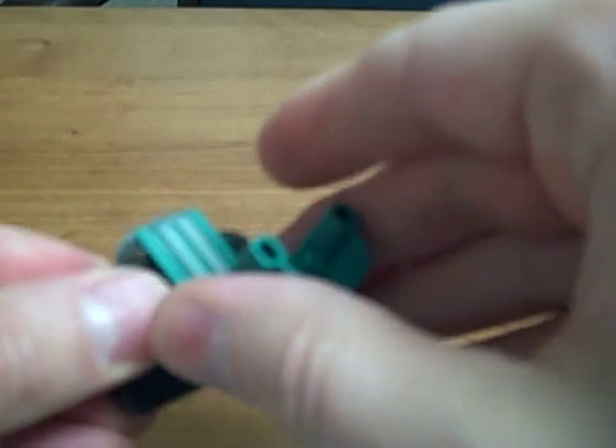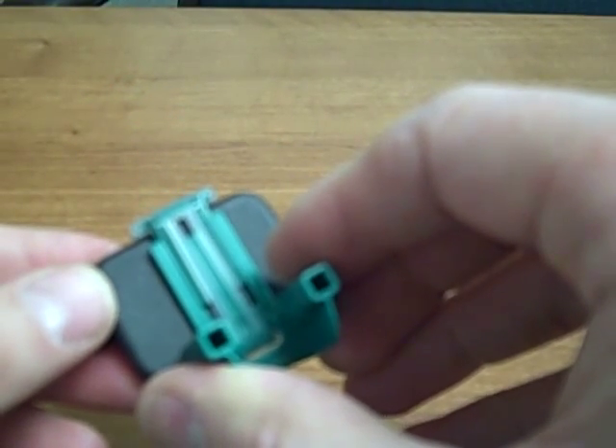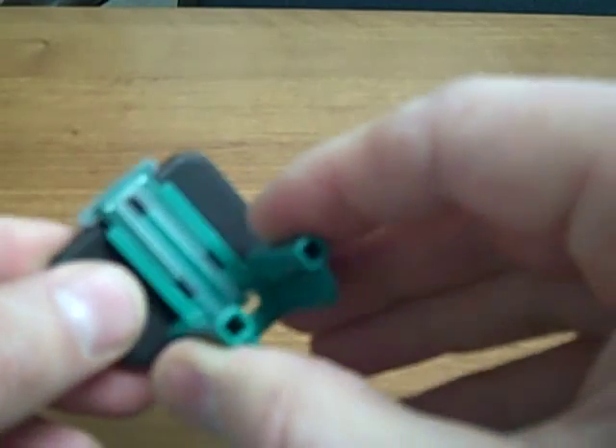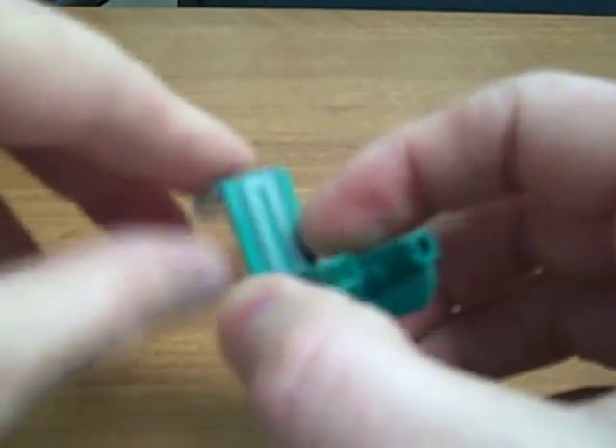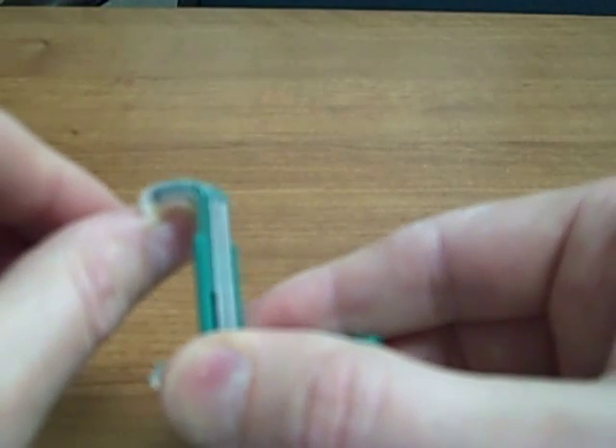And this is the endo bite block, which holds a size 2 in a horizontal orientation. You can also use a size 1 sensor with this bite block in the vertical orientation. It has enough adjustment to allow for a size 1 in the vertical, but size 2 is only for horizontal.